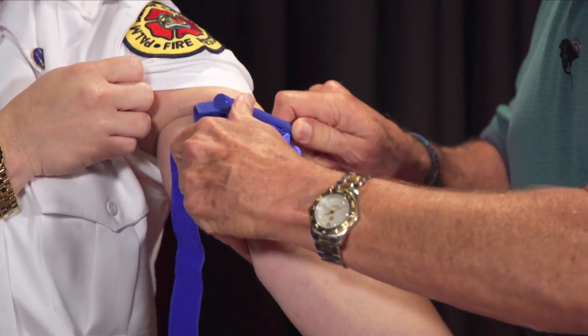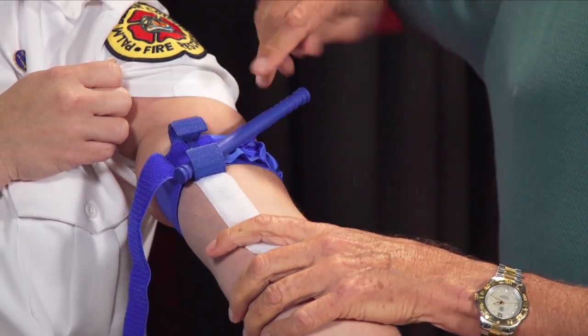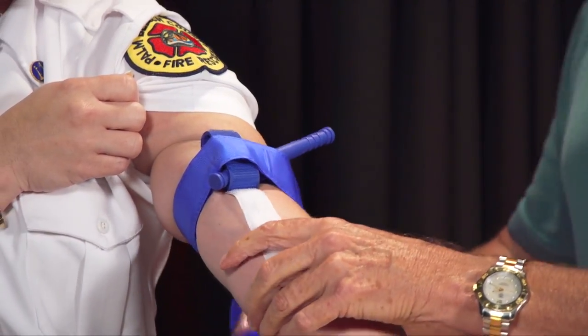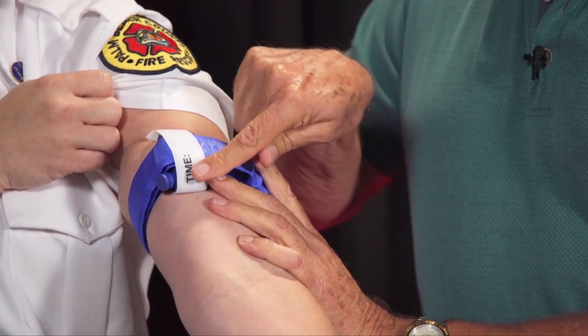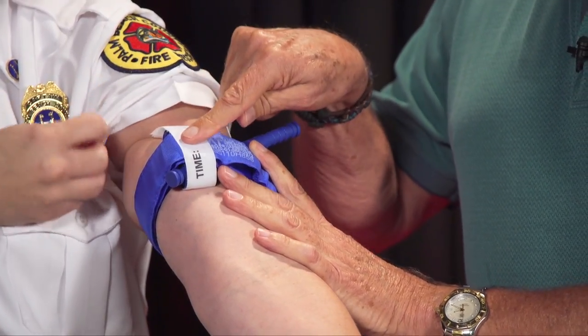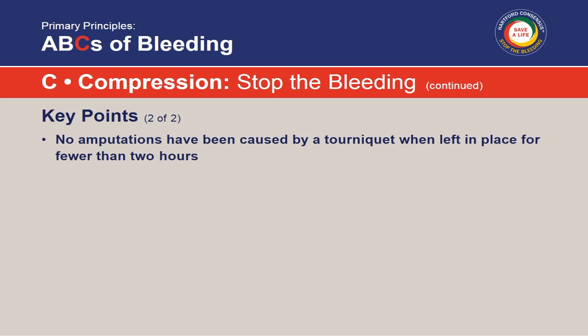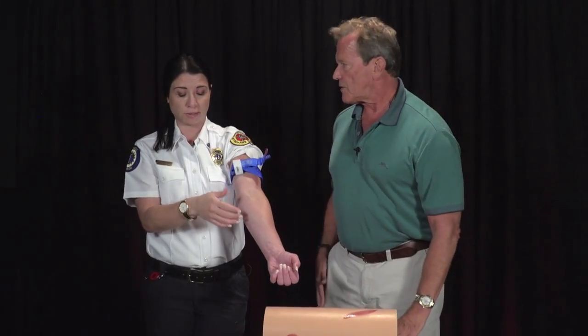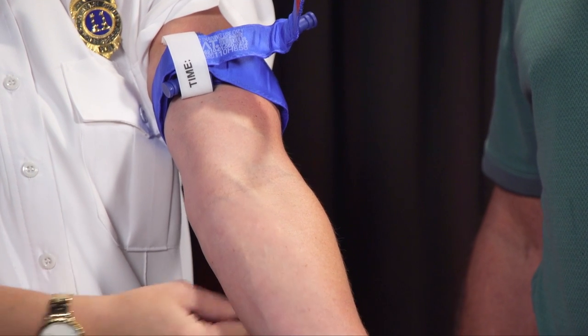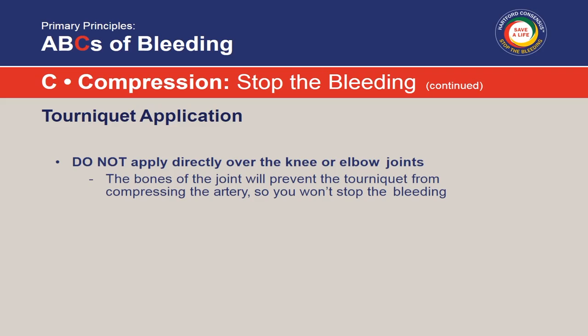After twisting the windlass to apply pressure, lock it into place with the clip. Take the slack out, and then put the securing strap over — that locks it in place. On the tourniquet there's a space to write the time it was applied. No amputations have ever been associated with tourniquets applied for two hours or less. In fact, in the Middle East and war theater, some tourniquets are left on four or five hours and they're still able to salvage the limb. Don't place the tourniquet over the wound or over a joint like the elbow or knee, as bony prominences prevent the needed circumferential pressure.